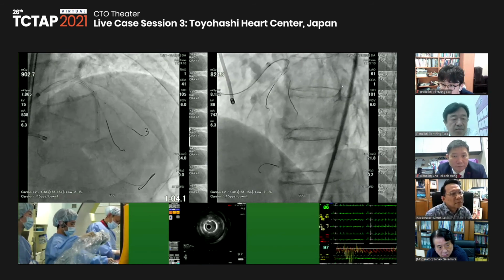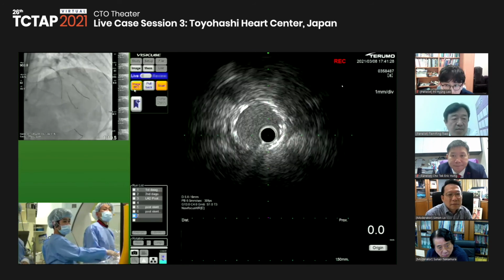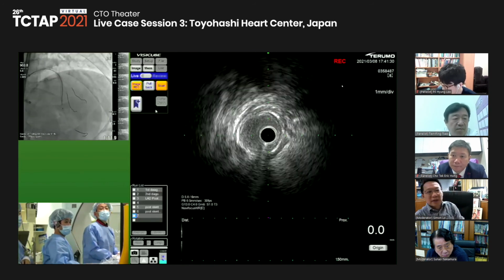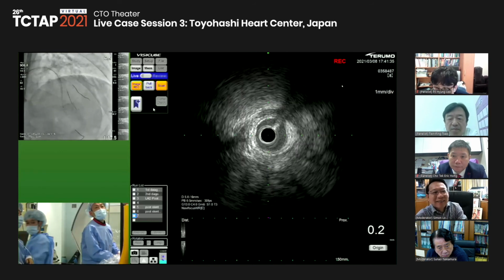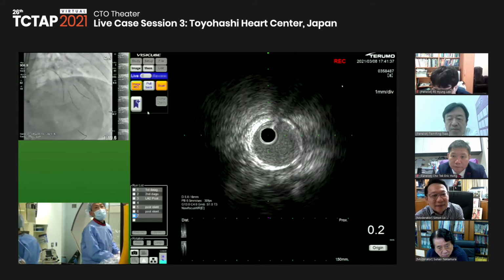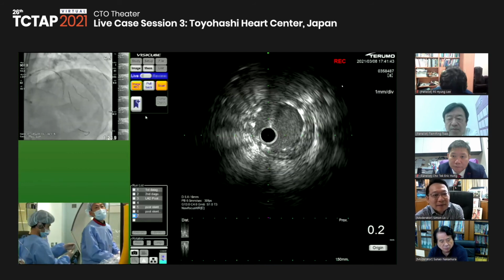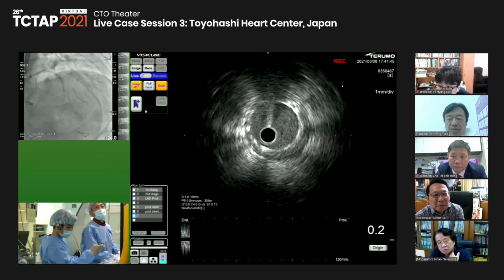Very nice. Maybe this base is still shrinking, but the edge of the stent is okay. So we already dilated with the 3.0 at high pressure. But this is the second diagonal.